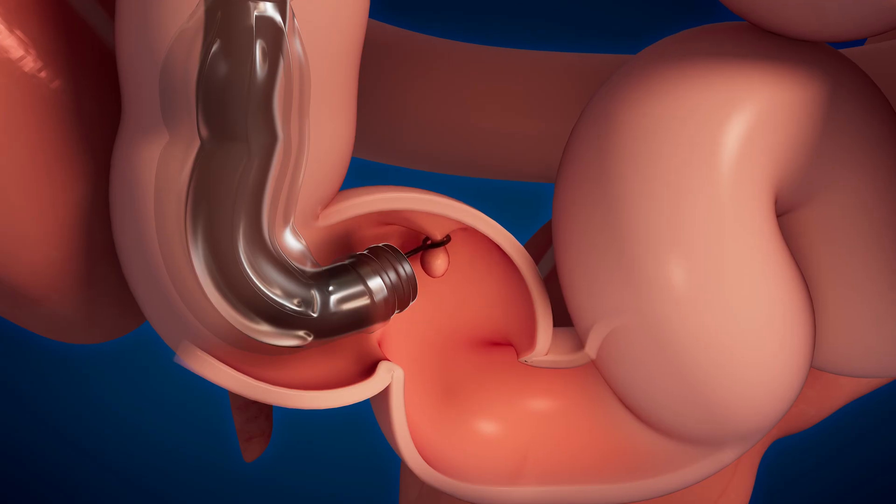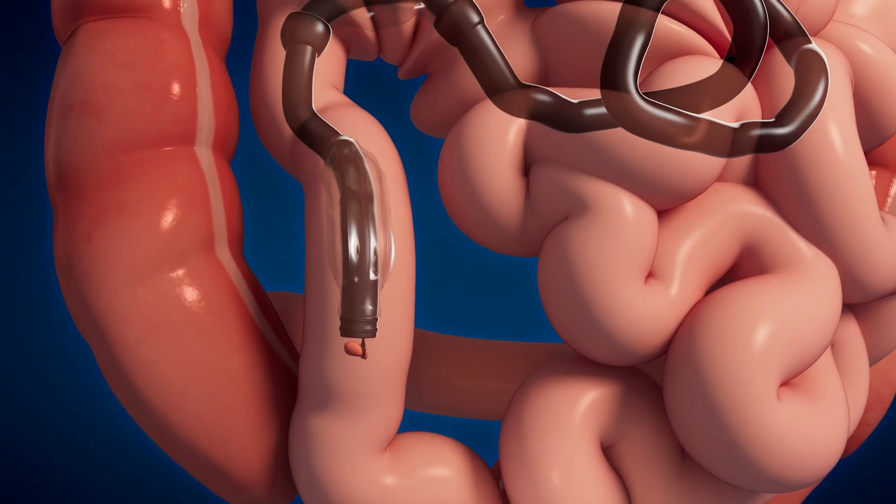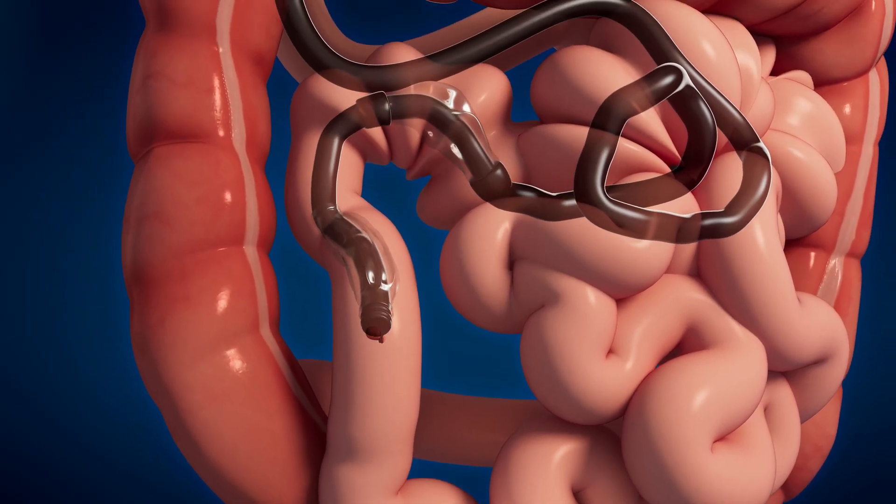The snare grasps the base of the polyp and using electrocautery the polyp is removed. The polyp is collected and sent to pathology for further evaluation.